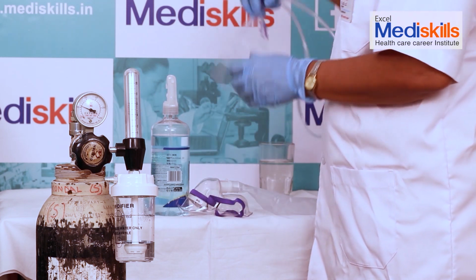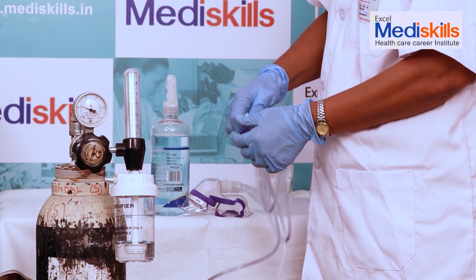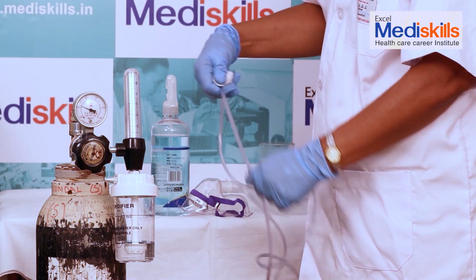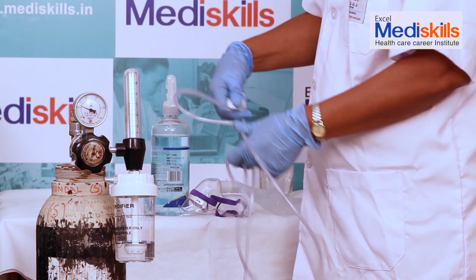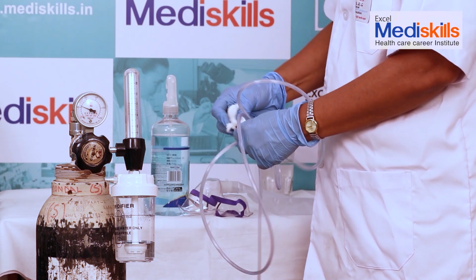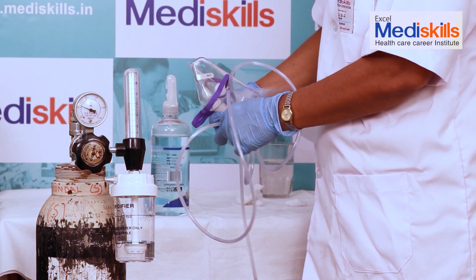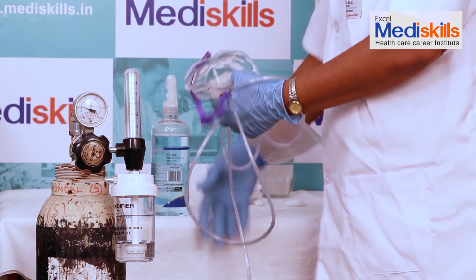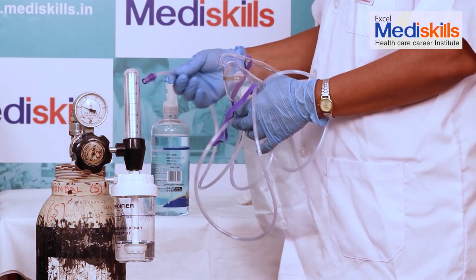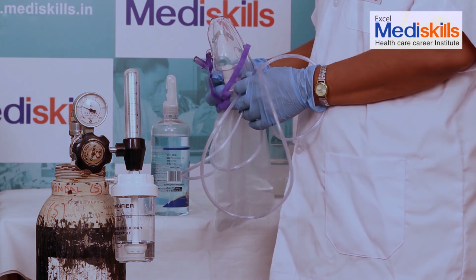Then we take the connector nozzle and disinfect it properly with alcohol swab. Now the bag mask is disinfected. The cylinder portion has to be attached to the cylinder and then oxygen supply is to be given to the patient. This is how we have learned how to give oxygen to a patient.